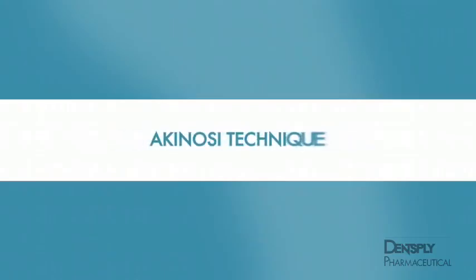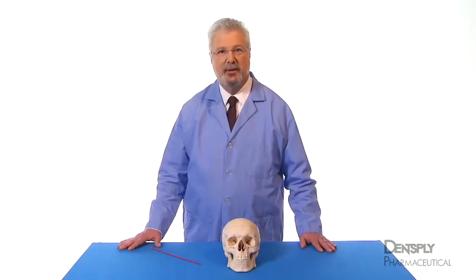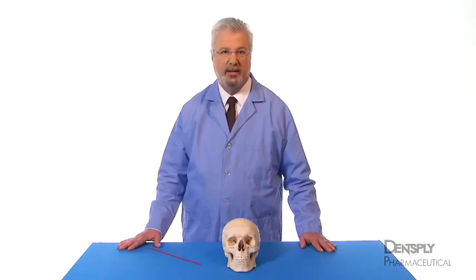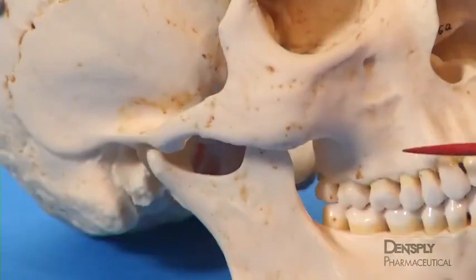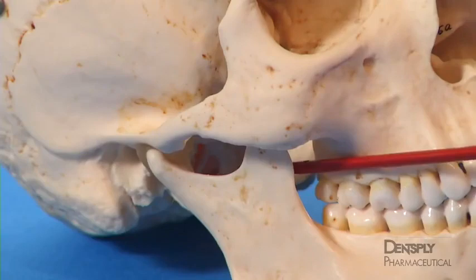Akinosi technique. The closed-mouth approach to mandibular anesthesia, or Akinosi technique, uses the cleft between the ramus and the maxilla in order to access the pterygomandibular space. Although the target for injection is not well identified, there being no bony contact to indicate proper insertion depth, the needle ends up in the pterygomandibular space somewhat superior and medial to the standard inferior alveolar nerve block.